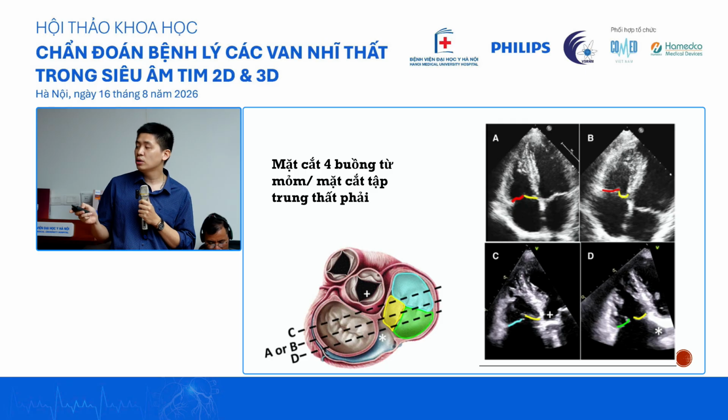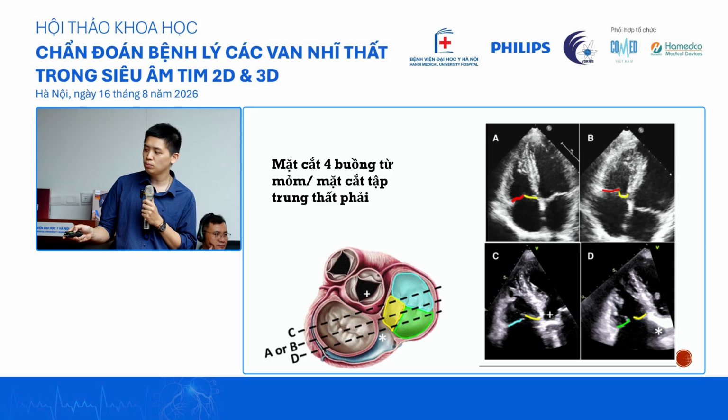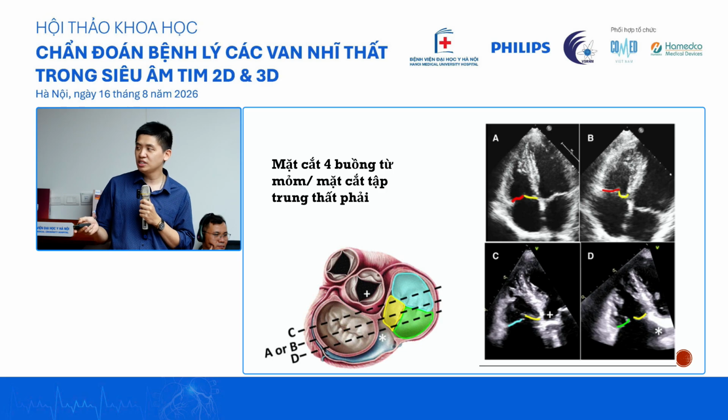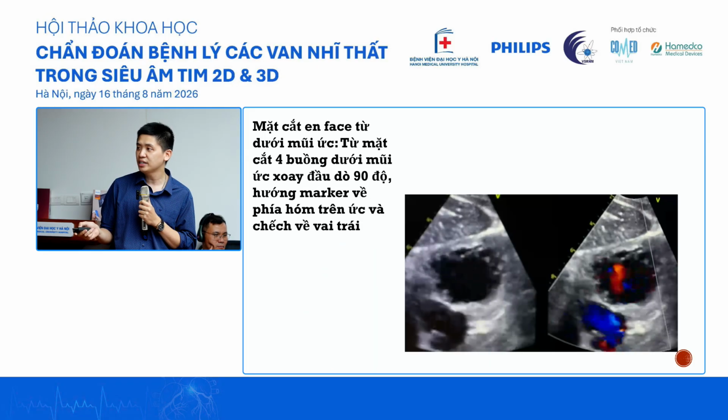In the four-chamber view or right ventricular focus view, you are only sure about the septal leaflet; the other one could be anything. If you tilt it a little bit and you see the start of the LVOT, you will know that you're actually cutting the anterior one, and if you see the coronary sinus, which is down below here, usually it could be the posterior one. But the thing about this is that this is not certain. There's no way to tell which one you are seeing. So on 2D, we have a lot of limitations in identifying the leaflet.